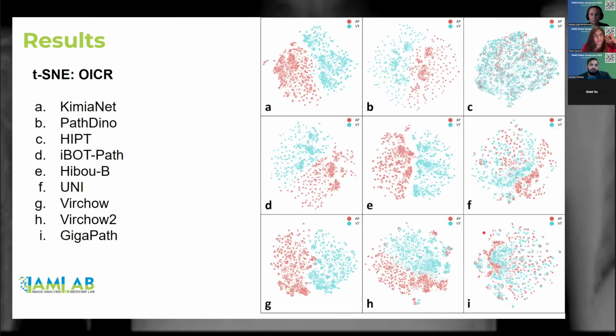We can also visualize the embeddings in 2D space based on the t-SNE plots. As we can see, all these are the corresponding patches from two different scanners, but we can still see a clear differentiation between the scanners for each model. Here we can see that the features are jumbled up. That means the model is considering them as one cluster, but in most of the models we can see there is a clear difference. Here we have mixed signals again for GigaPath, and for UNI we have clear mixed signals, but in some other cases we have a clear distinction.